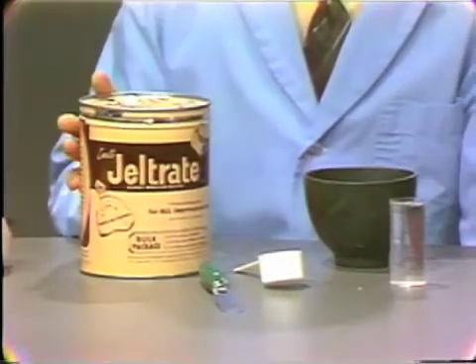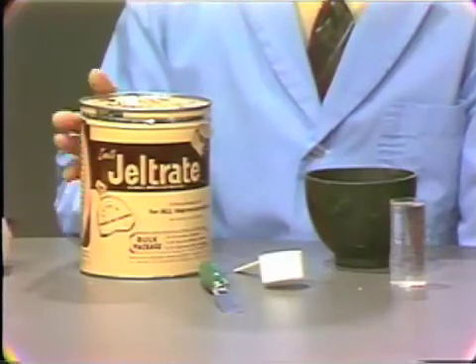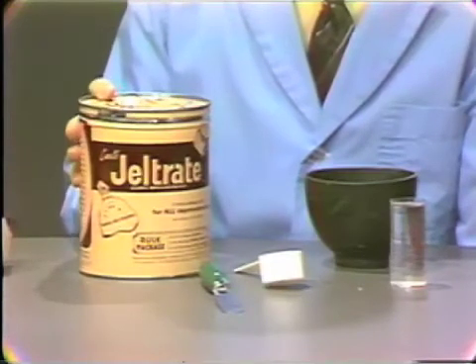The powder is mixed with water and then is spatulated. After complete spatulation of one minute for the regular set material, it is placed in the impression tray.